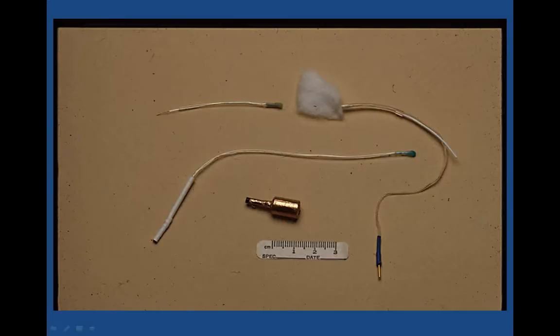You have to spend a bit of time talking about how we record these components, and I will say now that virtually all of the recordings that I make in my clinic, in my lab, are using the tympanic membrane approach. There are 4 different electrodes shown here that all have been used and may be currently used to do electrocochleography. This is one we used to use. It's a homemade device patterned on an electrode that was described back in 1987 by Steve Stoller and Paul Stypulkowski.